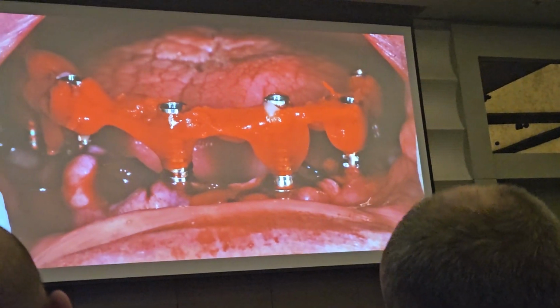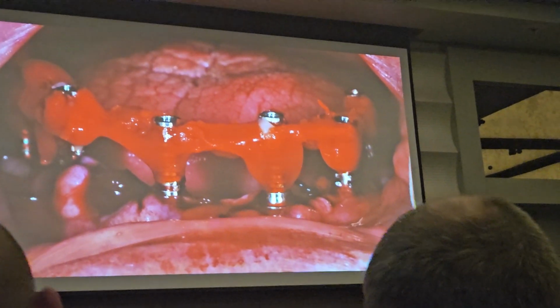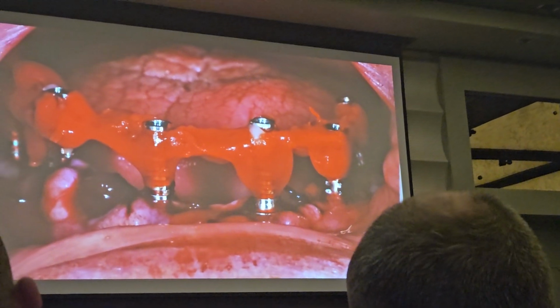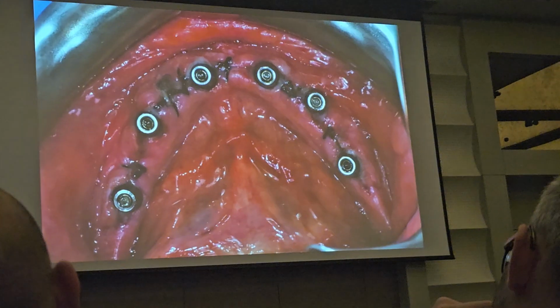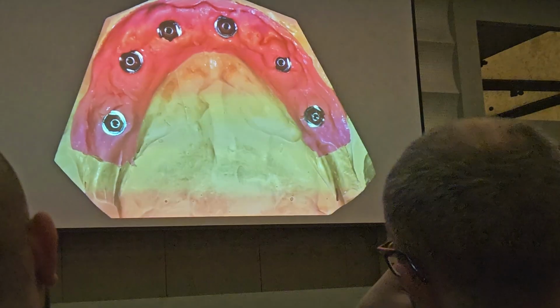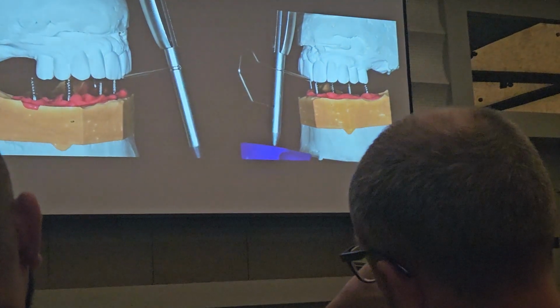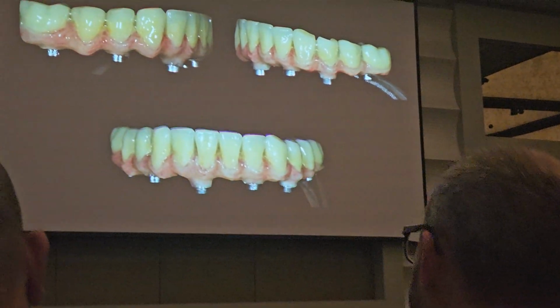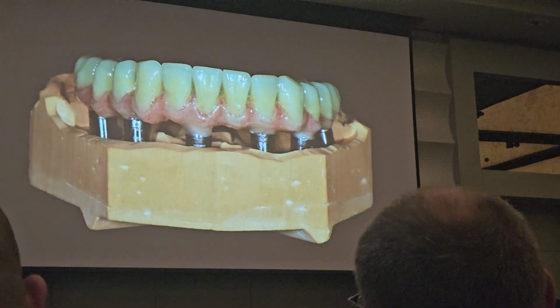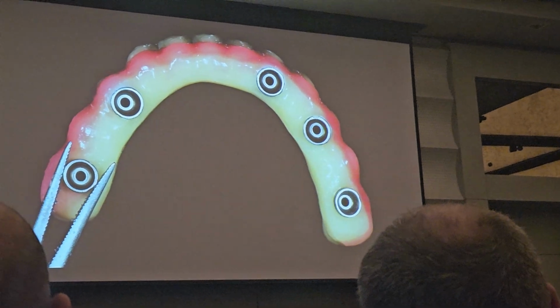Everything was perfect, easy surgery, guided. I just opened the flap for looking better at the bone, the level of the bone. Perfect impression, perfect photos, perfect provisionals. Provisional with the metal framework and layered with acrylic. Hygienic design.